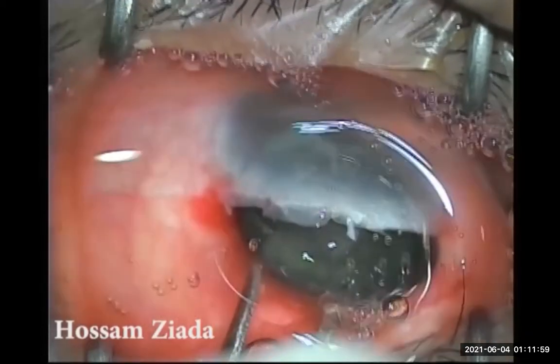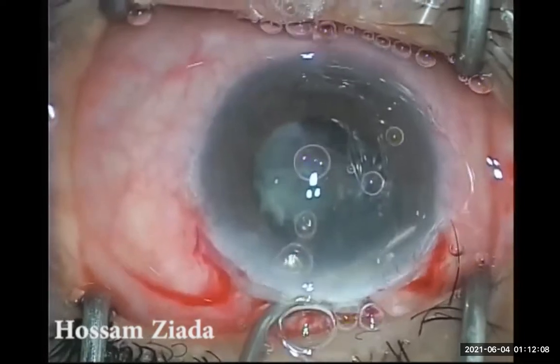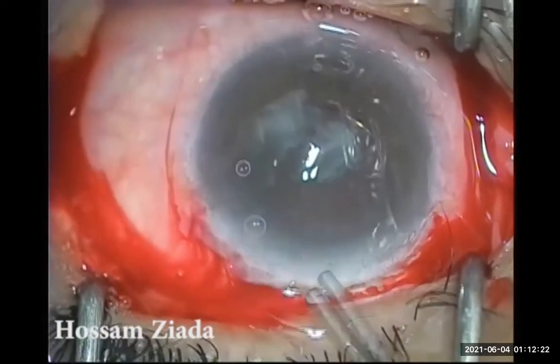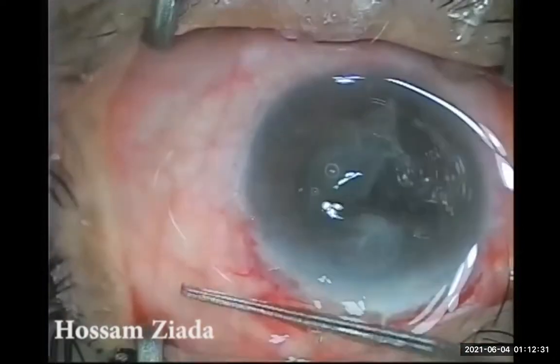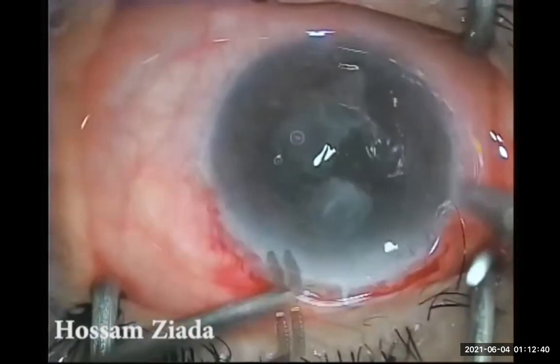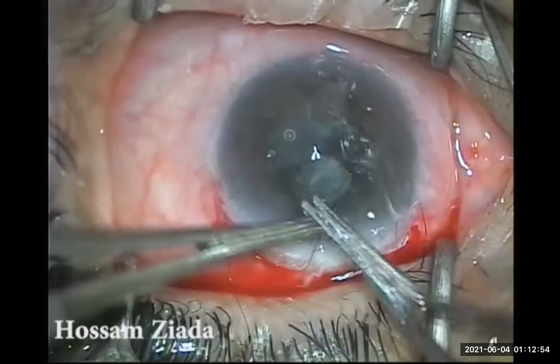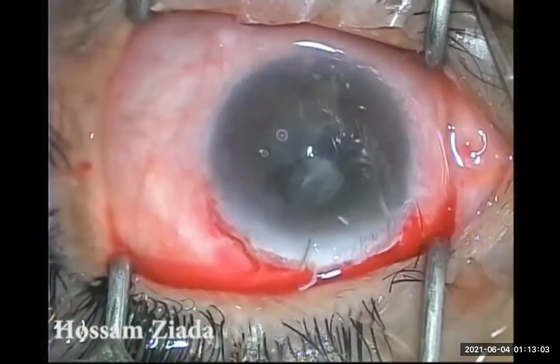Now I'm delivering the nucleus with the preferred way — pressing at six o'clock to tumble the nucleus, and then placing the other instrument with sustained downward pressure to deliver it with ease. Now the other fragments I pull away to the side in the anterior chamber, and I place the PMMA IOL in the bag and rotate it under these fragments to act as a scaffold to protect the posterior capsule from any stretching or insult. Then I place the central stitch at 12 o'clock — just one stitch — and you will see that this stitch will be very helpful and almost enough to seal the wound, which was eight millimeters in length.